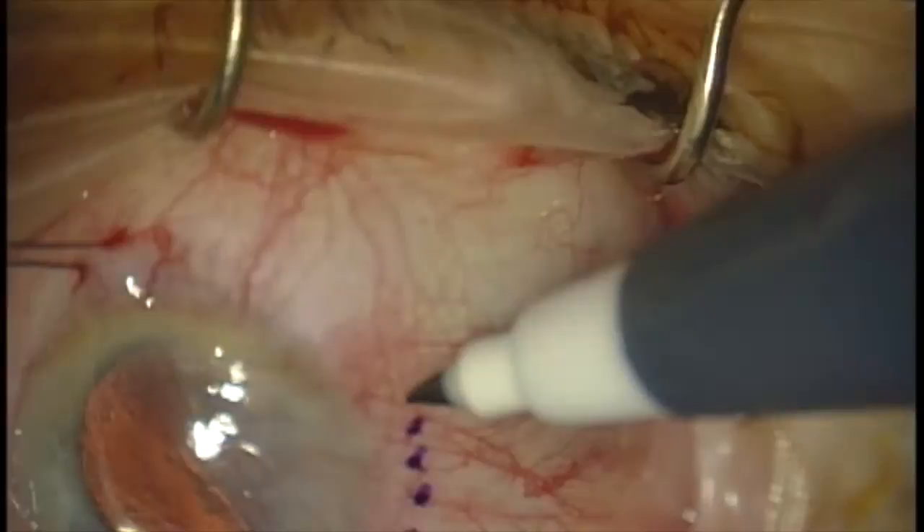Here we're placing a 6-0 Vicryl traction suture in the conjunctiva, and we're marking the area for planned excision of the pterygium.